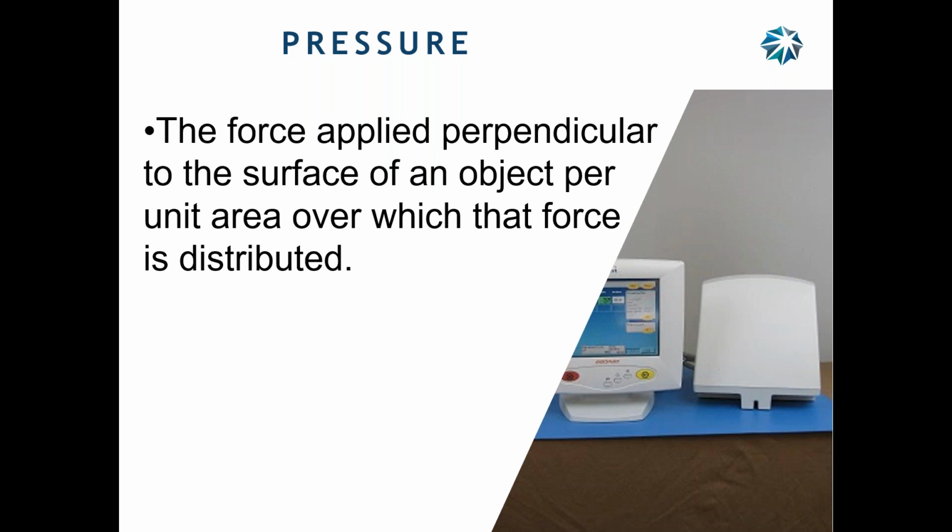Why is there greater pressure? Why do I need greater pressure? Well, you're getting there. What determines pressure? What determines how much pressure you need? Flow rate. Higher the flow rate equals higher pressure. Lower the flow rate, lower the pressure.